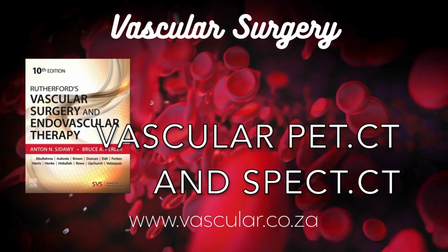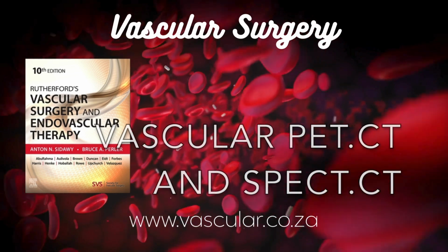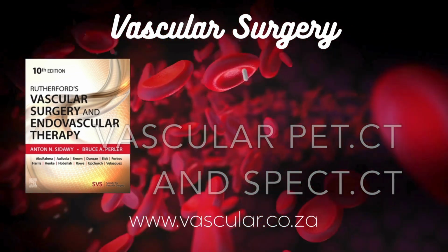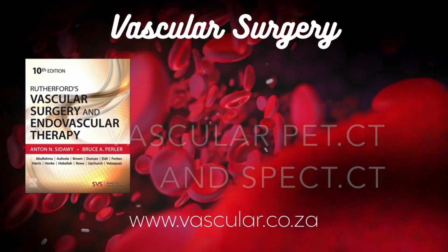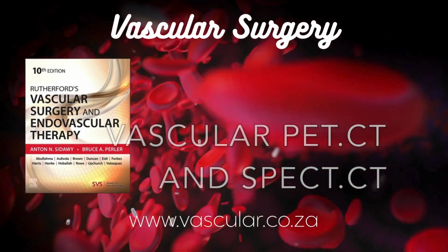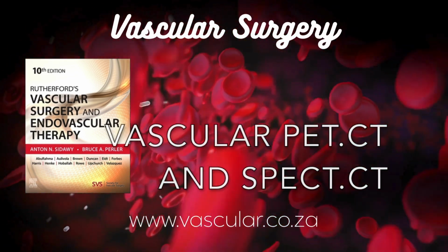Let's touch briefly again on the other tracers mentioned for plaque, NaF, LDL, antibodies, etc., just to recap their potential roles. Sure. NaF, as we said, targets active calcification. Labeled LDL or oxidized LDL aims for macrophage-rich fatty areas. Platelet or fibrin tracers look for thrombus formation. Annexin V looks for cell death. IL-2 for activated T cells.